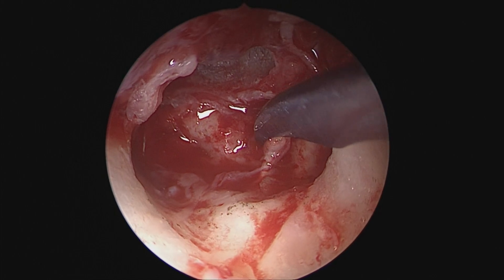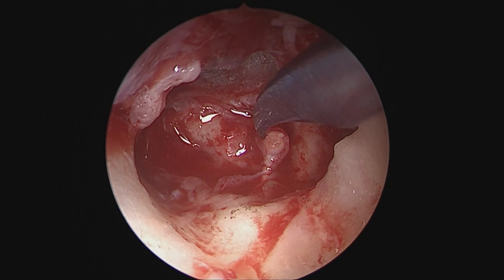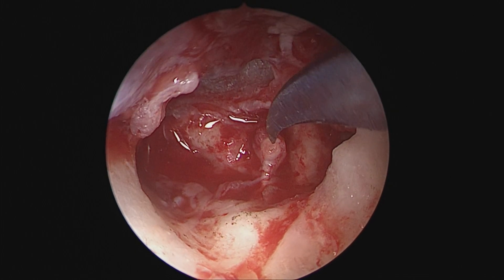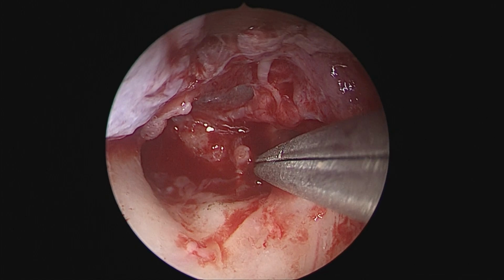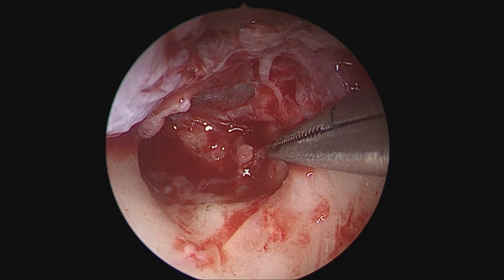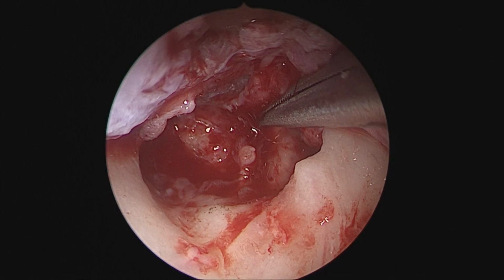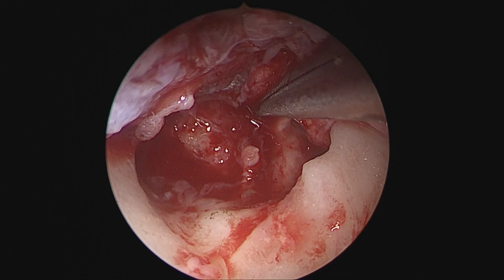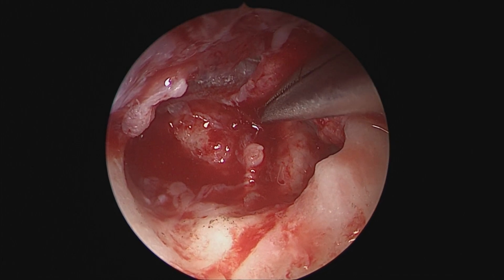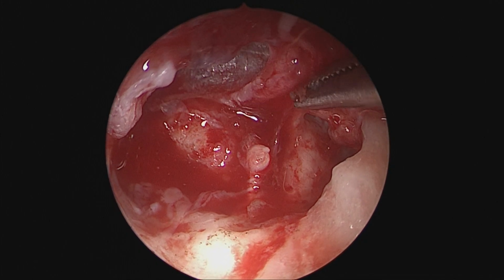One may or may not also use lasers for this kind of step to denude the stapes more, but from a practical standpoint, it may not be required. So we use a very fine microforceps to remove the last bits of the excess mucosa over the stapes head. Now this has to be done very delicately from posterior to anterior in the direction of the stapedius.